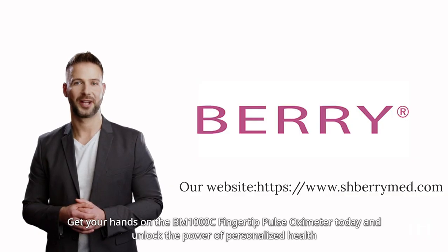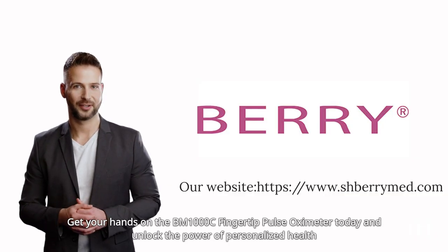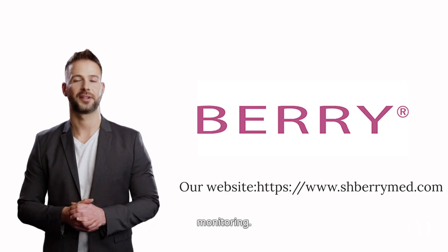Get your hands on the BM-1000C Fingertip Pulse Oximeter today and unlock the power of personalized health monitoring.